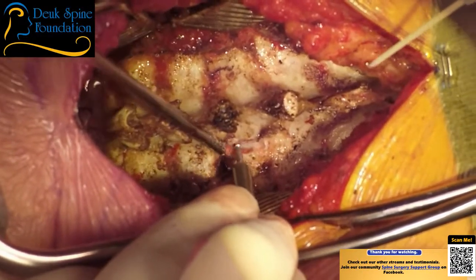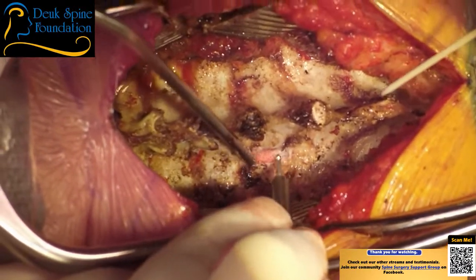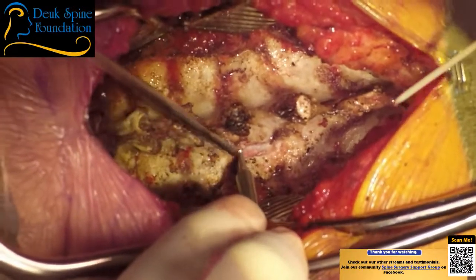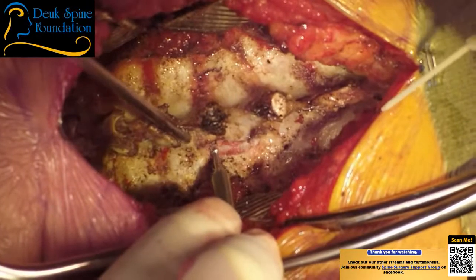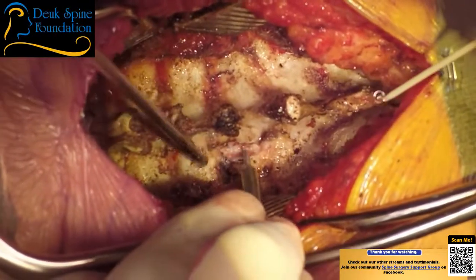And Dr. Patel is doing a great job. There's the inner cortical table, and below that is dura. There'll be some ligamentum flavum as well. Here's the foramen, bottom of the foramen. Uh-huh, nice job.